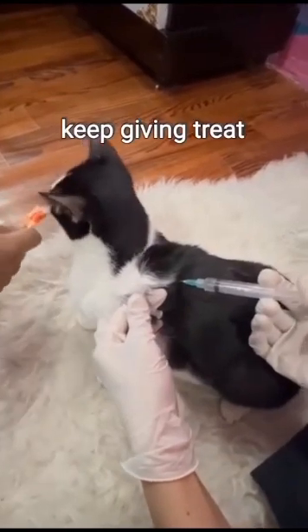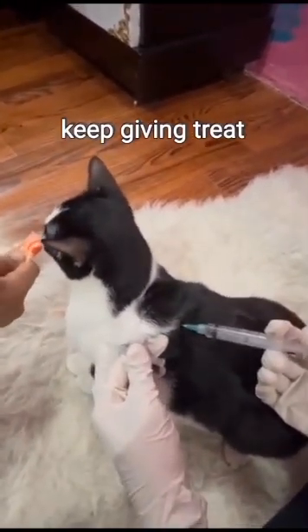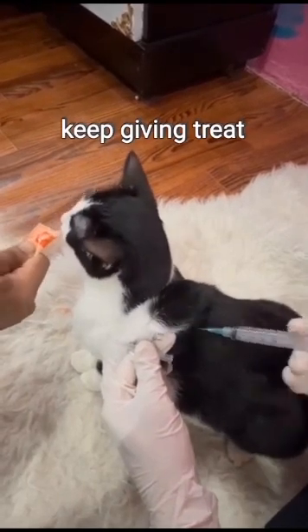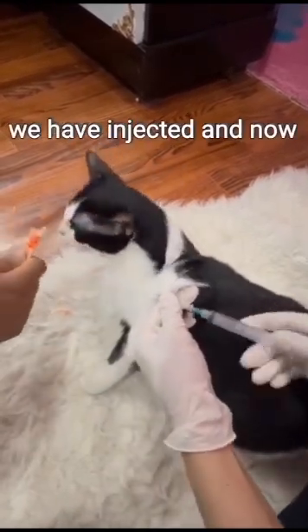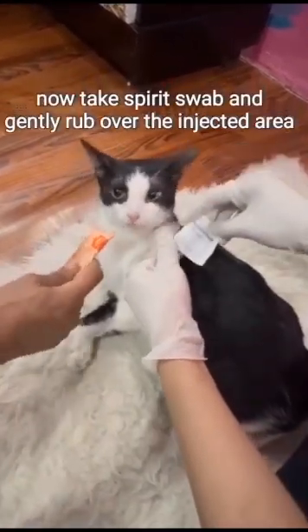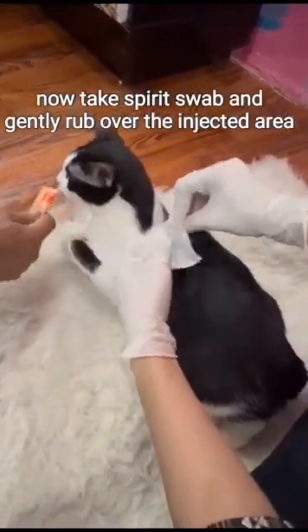Keep giving the treat. We have injected. Now take a spirit swab and gently rub over the injected area.